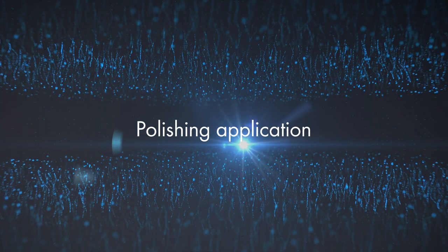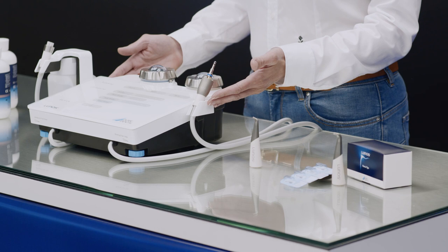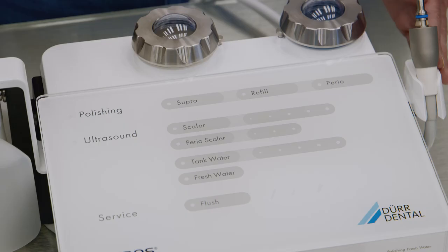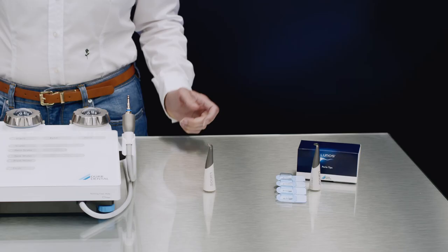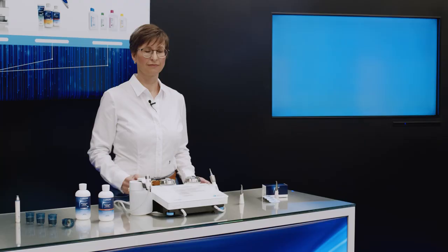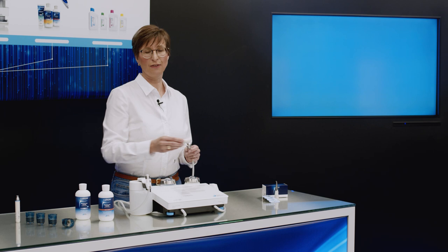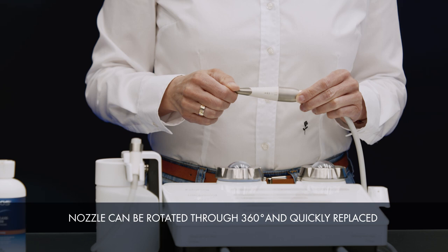Now let's take a look at the functions. First of all, we have the handpiece for the powder flow application, which is referred to as polishing on the device. For this handpiece, we provide our two tried-and-tested LUNOS prophylaxis nozzles for supragingival and subgingival application. The nozzles are simply attached to the handpiece and can be rotated through 360 degrees, meaning that even hard-to-reach places in the patient's mouth are more easily accessible.